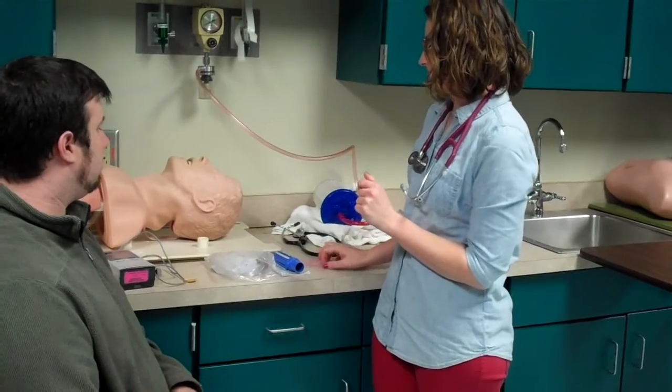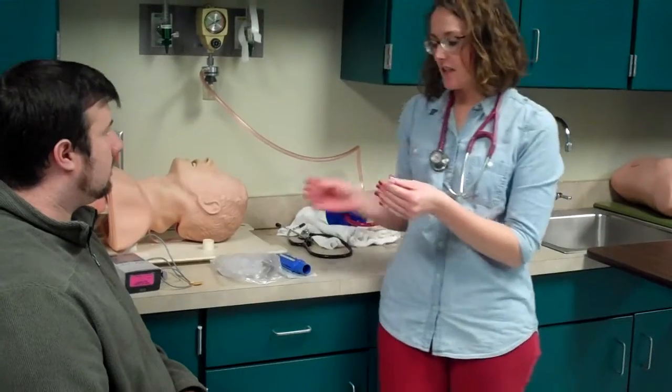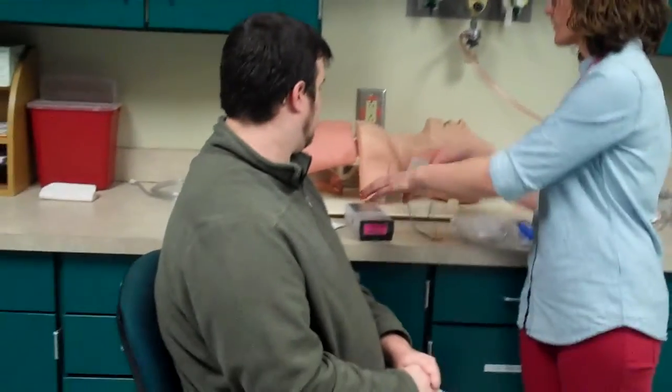No? So you have some family in the room. Is that okay if they stay? Okay, do y'all have any questions? Yeah, we have one. What kind of medication is he going to be getting? Was it the Proventil stuff? It is Proventil. It's a bronchodilator. What it's going to do is kind of open up your airways for you, help you breathe a little bit better. Okay, good. I think that you were saying you were short of breath. That should help. All right, I'm going to check heart rate, respiratory rate, SpO2, color, level of dyspnea. I'm going to listen to breath sounds as well.